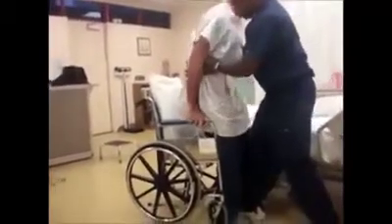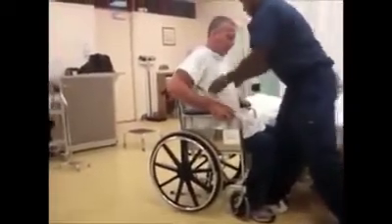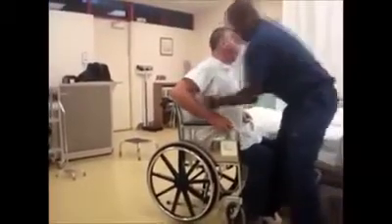Just you take the chair now. Sit down. Thank you, Mr. Gonzalez. We're going to have your X-ray, okay?